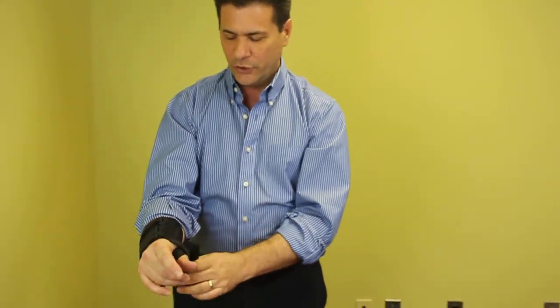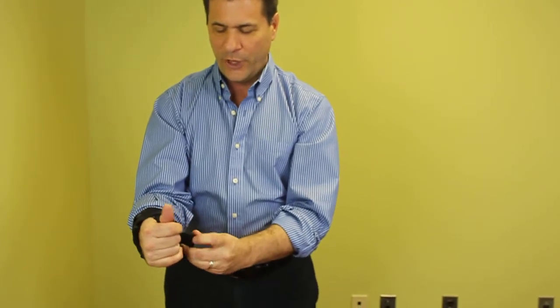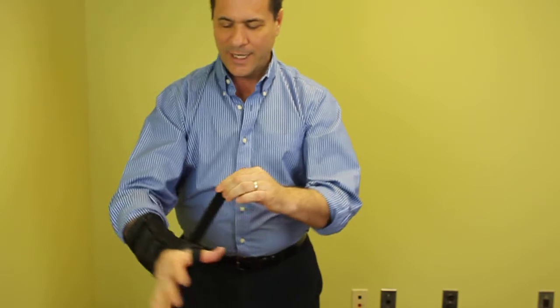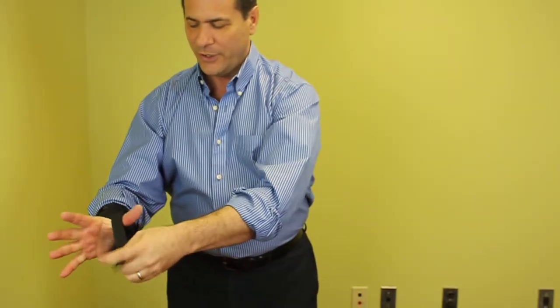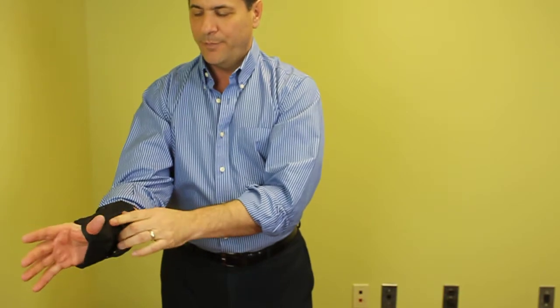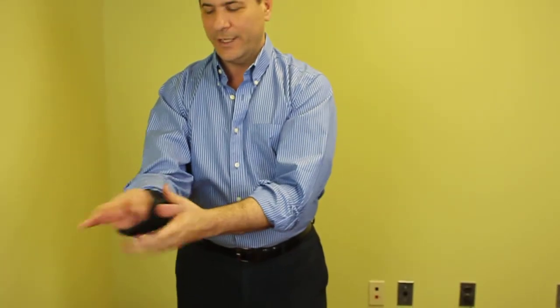Now we have this other additional strap here, which is for the thumb. What you would do is take it, wrap it around the inside of the thumb, and come back around, and put that Velcro there. Again, you can cut off the excess strap.